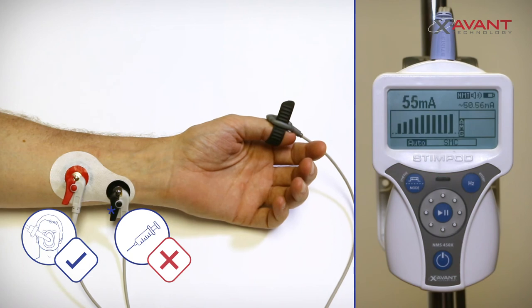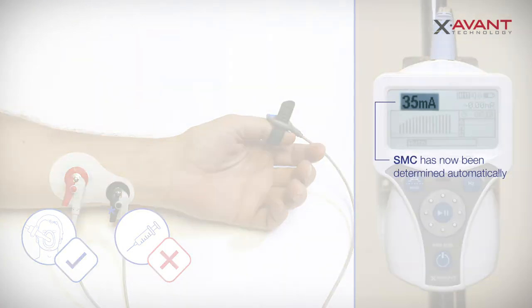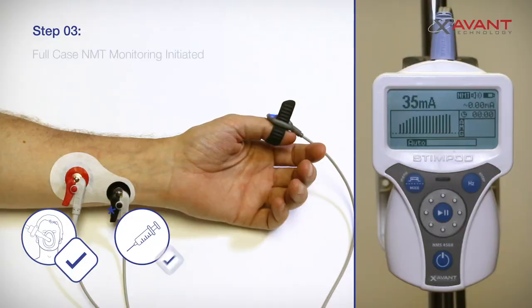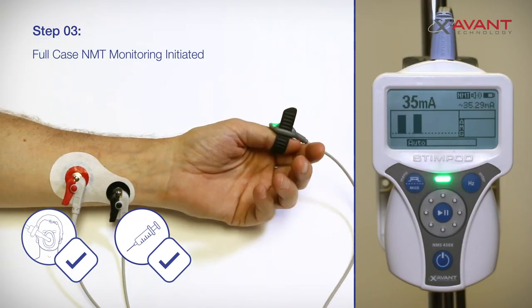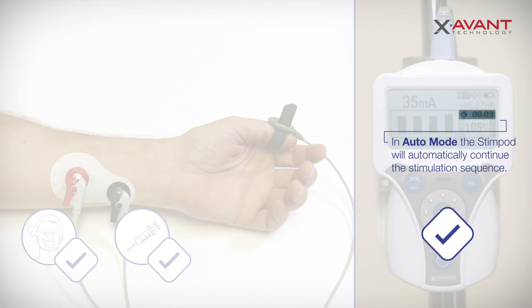The Stimpod will now confirm your electrode placement and determine the optimal current for your setup. At the end of the sequence, the current will be set at the determined supermaximal current. Full case monitoring has now been initiated, and the Stimpod will continuously and autonomously monitor your patient's depth of block, guiding your patient through to a safe extubation.